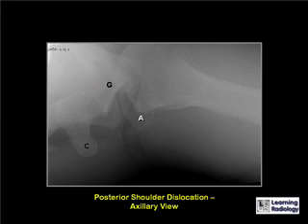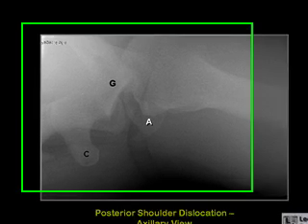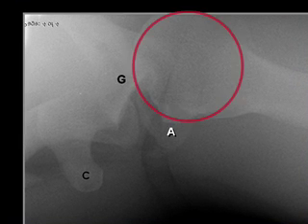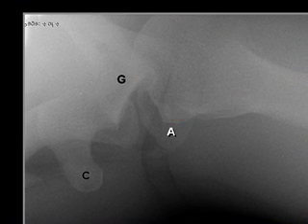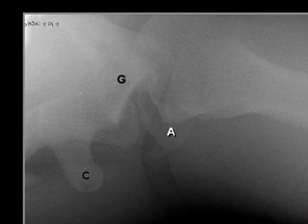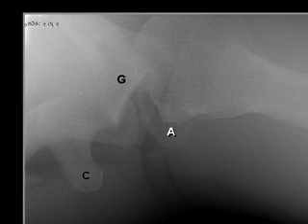This is an axillary view of an individual with a posterior dislocation. That is the humeral head, which lies outside the glenoid marked by the G, and closer to the acromion than to the coracoid process.